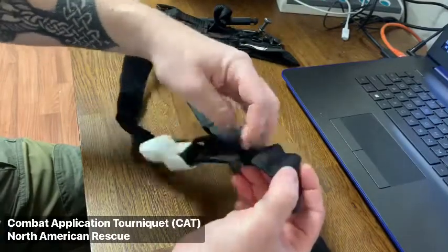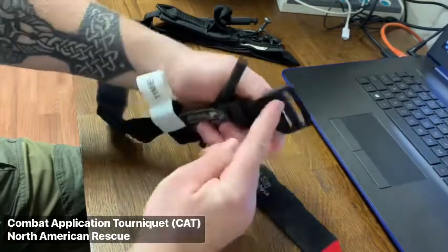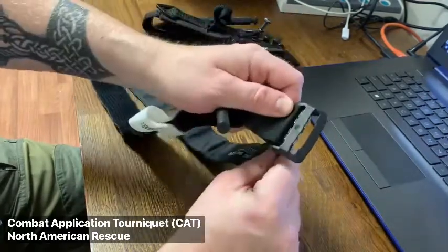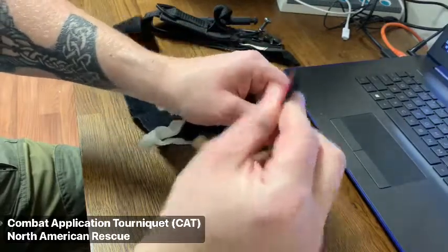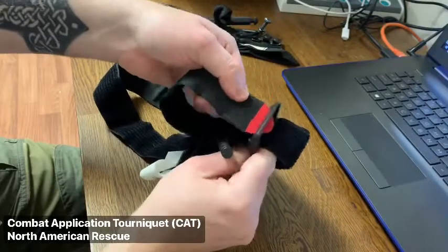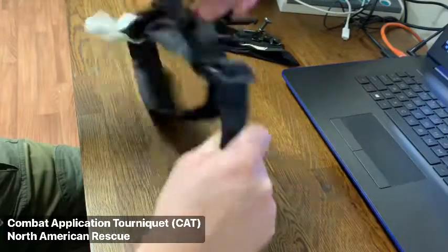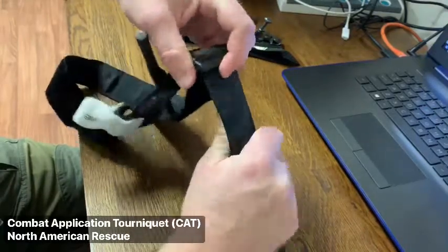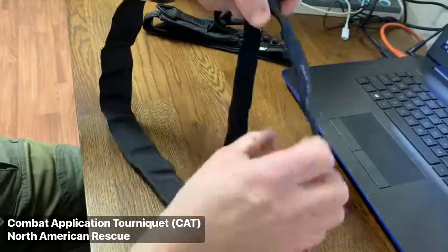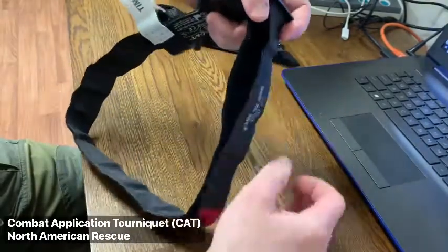This generation utilizes a double eyelet buckle system. To ensure secure application, the band must be inserted through both eyelets. Once you have tightened the band sufficiently, the remaining length of the band can be secured directly to itself. The band has an attached and built-in Velcro system.